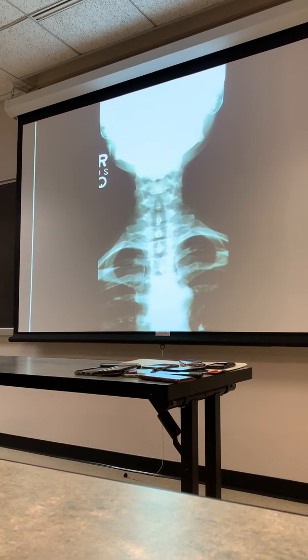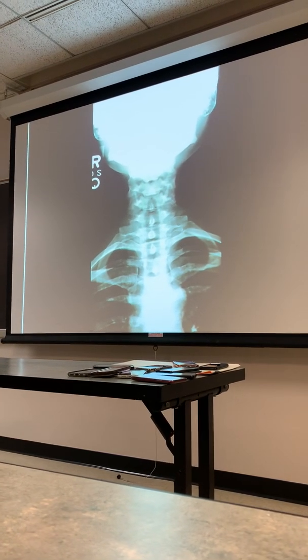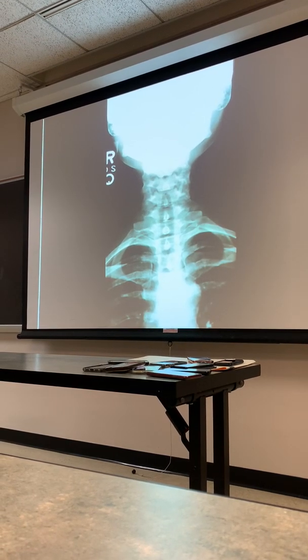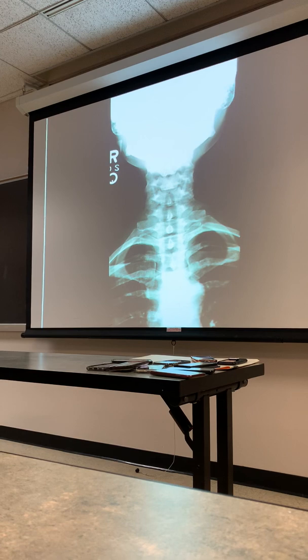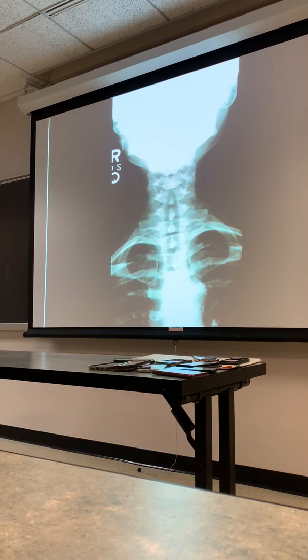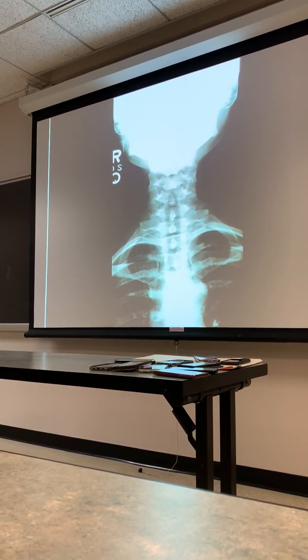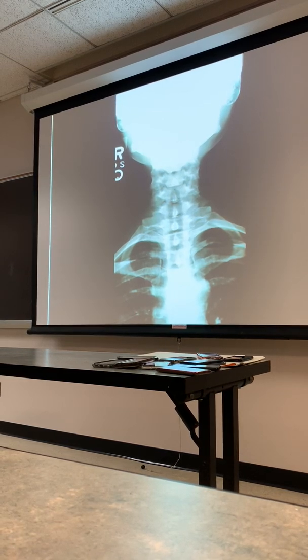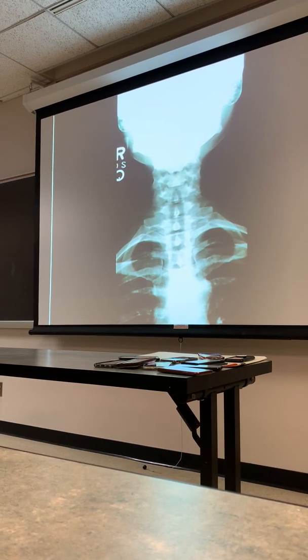Ready? All right, AP projection. Number 2, place the mid-sagittal plane of the patient's body perpendicular. Mid-sagittal plane is perpendicular to the midline. What's the mid-coronal? Parallel. They're always going to be opposite, guys.